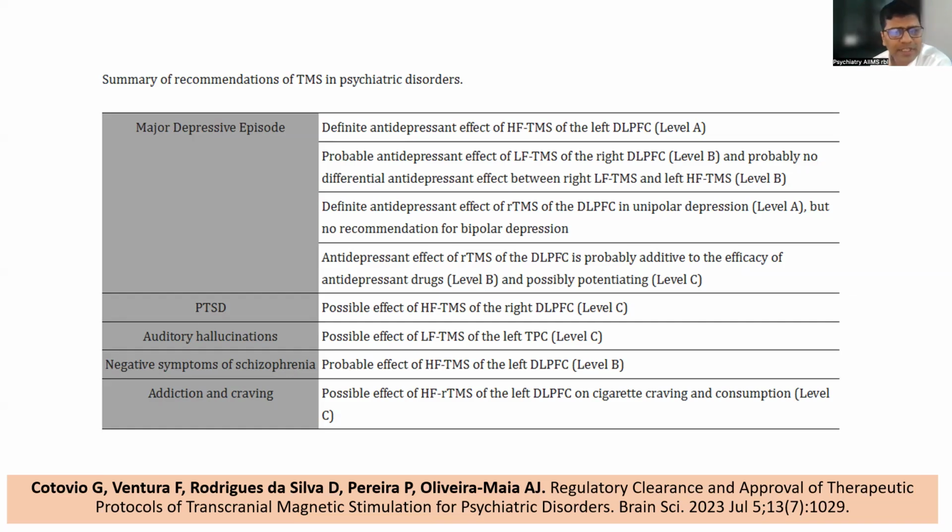Addiction is another emerging area where the possible effect of high frequency rTMS over left DLPFC is being studied in smoking and alcohol use disorder as well as in cocaine use disorder. So there are some emerging evidences. The level of evidence is level C.